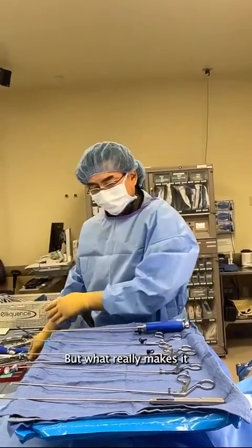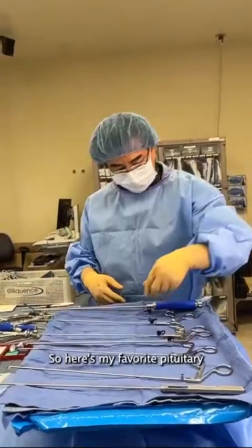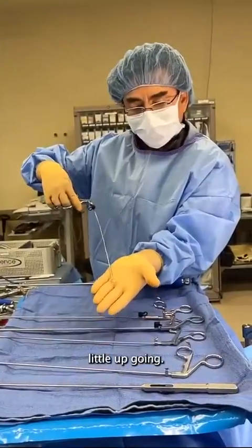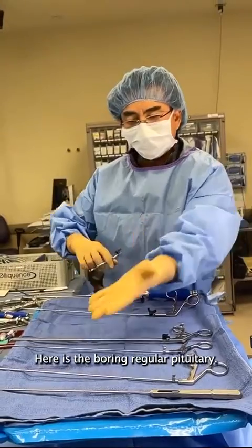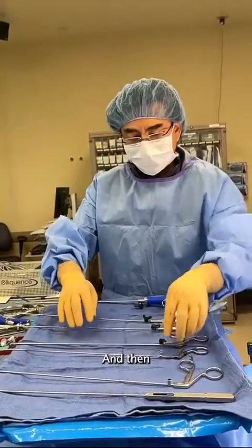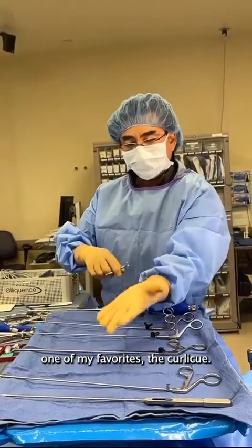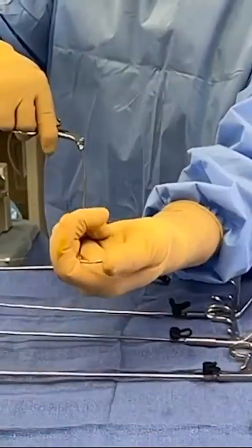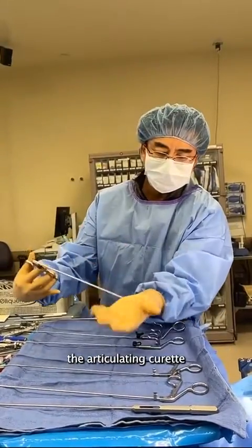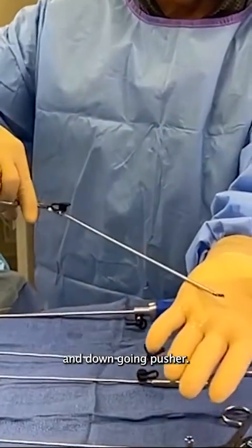But what really makes it are my favorite tools right here. So here's my favorite pituitary — a little up-going. Here's the boring, regular pituitary. And then one of my favorites: the curlicue. See how it's curved? And then the latest: the articulating curette and down-going pusher.